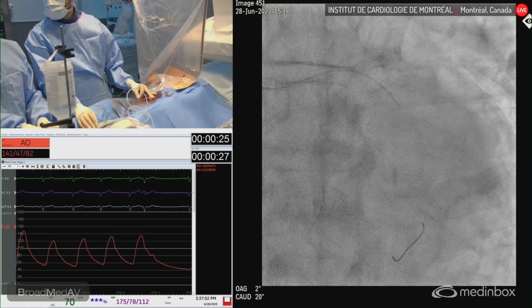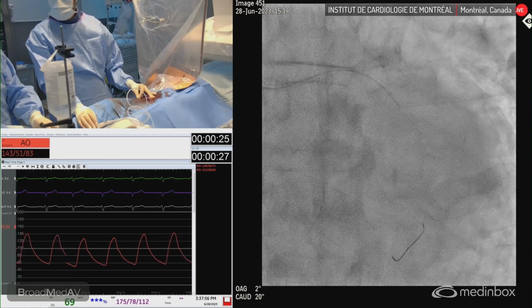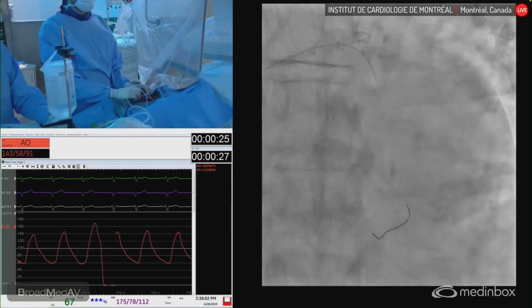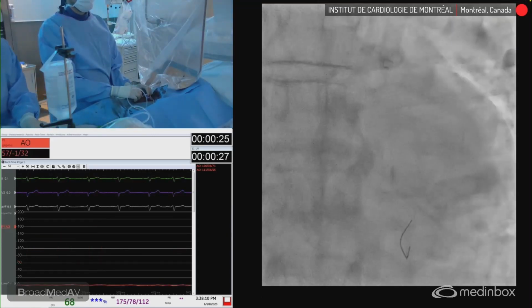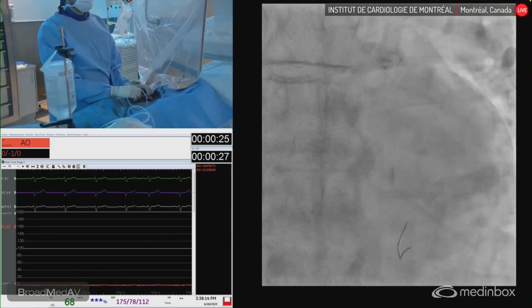It's on, but let me see. Click on the blue one over there on the console. Okay, let's just remove it. Just a second. Perfect. We actually need the glide assist in this situation.